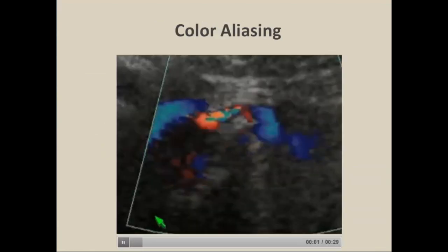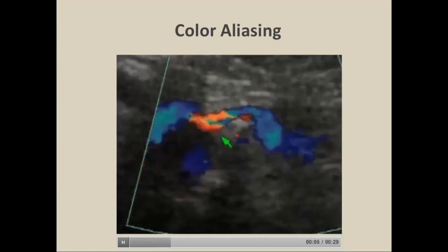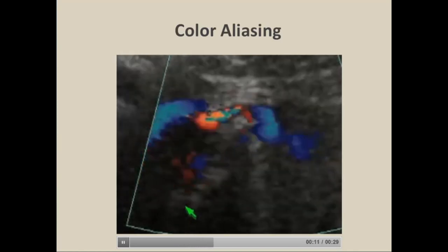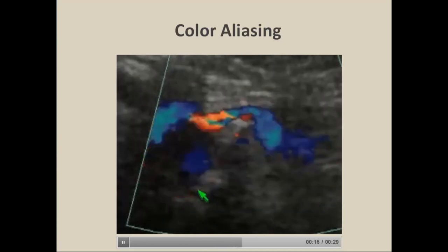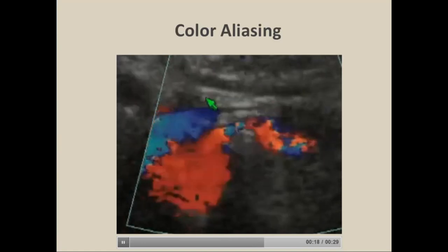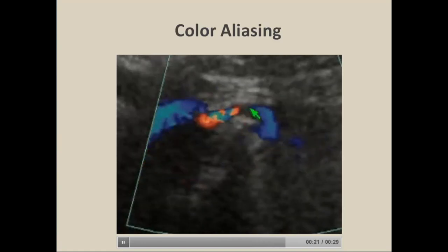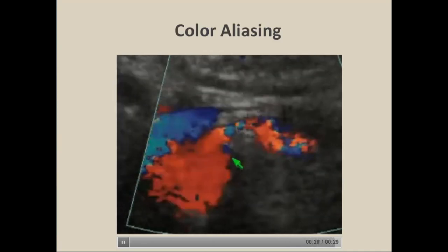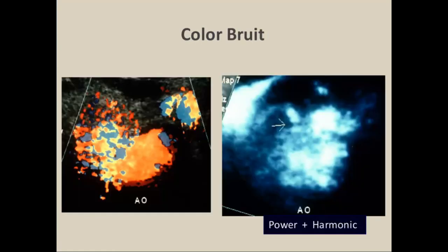Here's an example in real time showing aliasing near the origin of the left renal artery — a focal color change where the color wraps around from red to yellow to white to blue as it crosses the top of the velocity scale. You can also appreciate a bruit artifact from perivascular tissue vibration caused by very high-velocity flow striking the tissue. Here's another example of a color bruit artifact indicating significant stenosis at the origin of the right renal artery. Using a combination of power Doppler and harmonic imaging reduces that artifact, revealing a very tight focal stenosis at the origin.